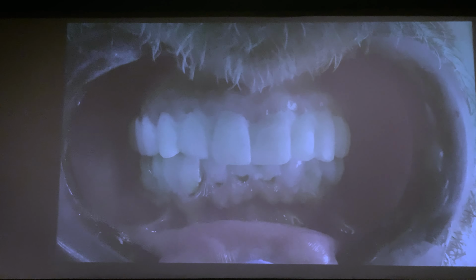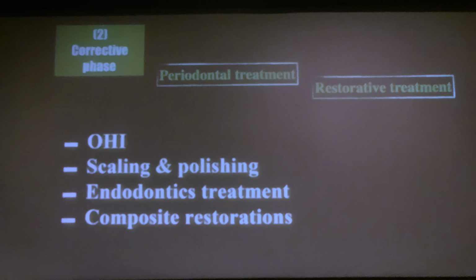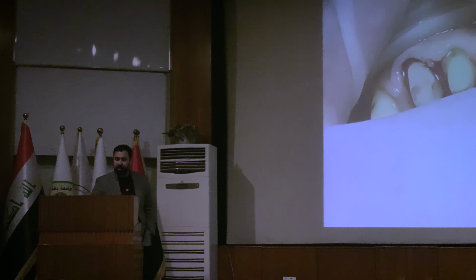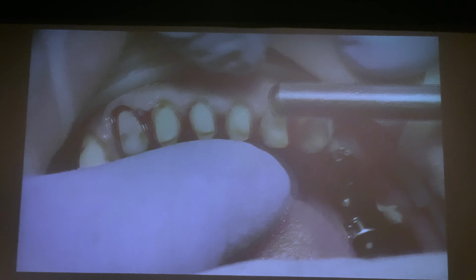Up and down, left and right, checking static and dynamic occlusion. Moving to the second phase, the corrective phase, where we're doing the scaling, polishing, endodontic treatment, composite restorations. And this video, although it's from the preparation visit, we can see clearly there is a slight mobility.